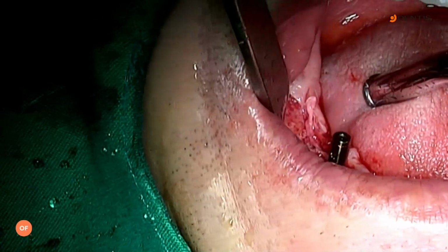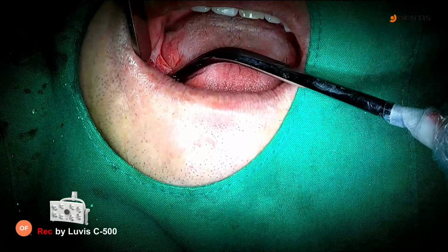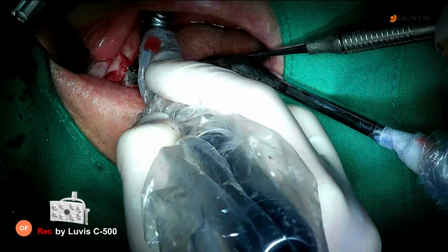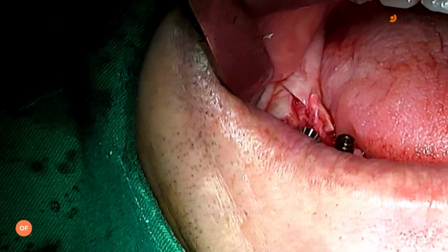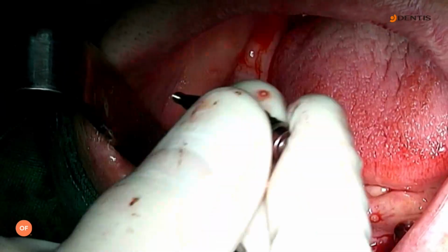Okay, today's final lower jaw implant. Just 5.0, 8 millimeter SQ implant. Okay, very good primary stability. So I control the depth. In the immediate placement, a little bit deep placement is better. Maybe from the lingual wall, 3 to 4 millimeter maximum depth.